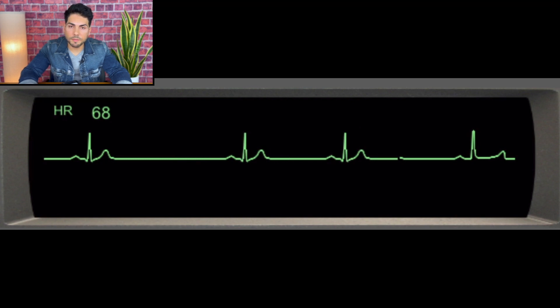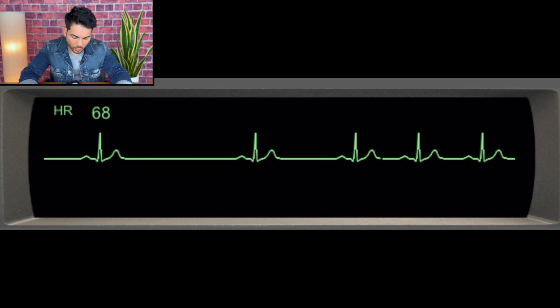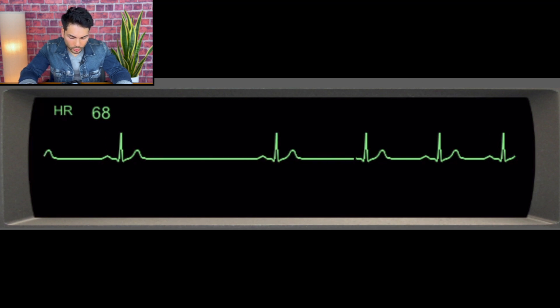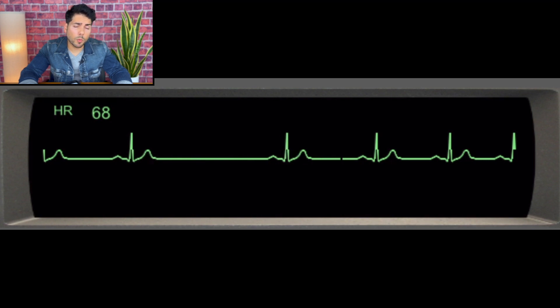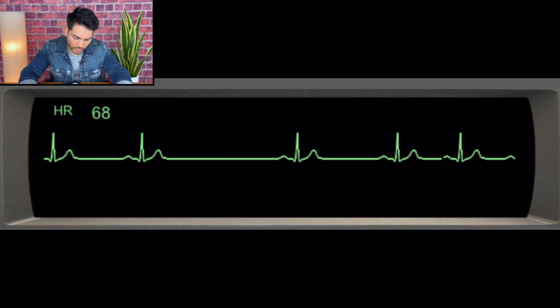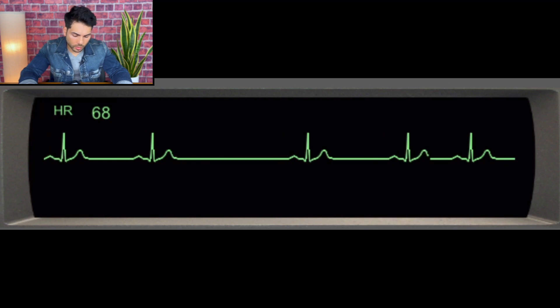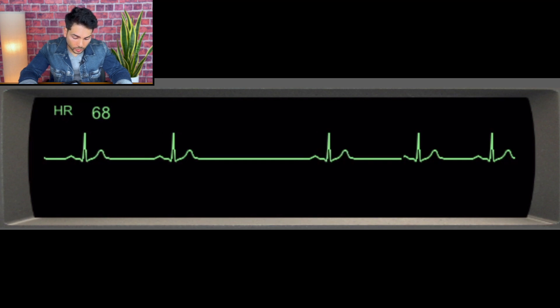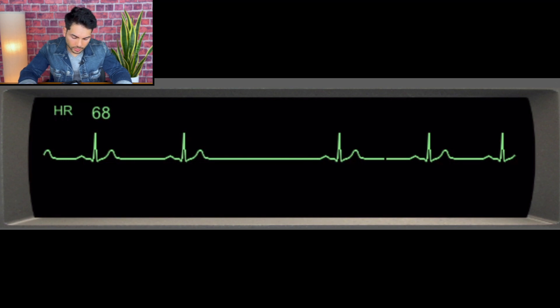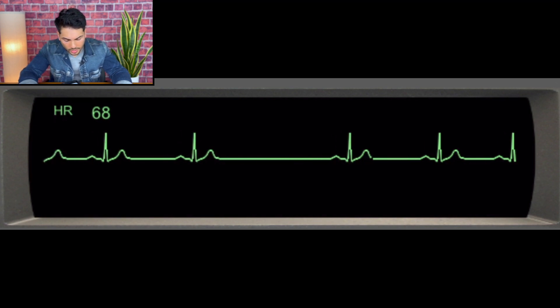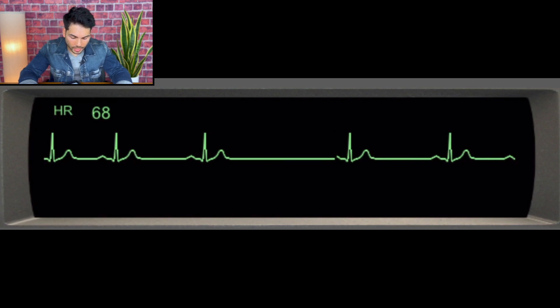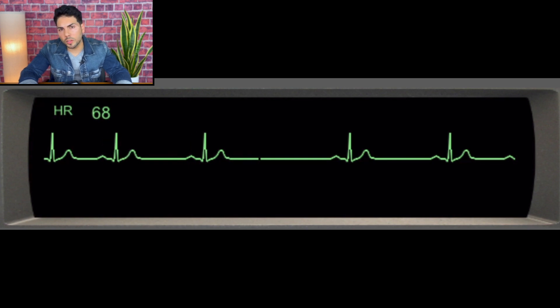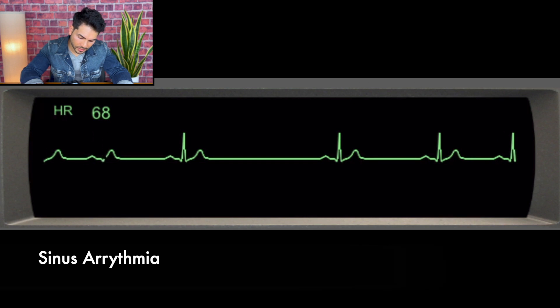Next example — same five questions. Are there P waves? Yes. Is there a P wave for every QRS in a one-to-one fashion? Yes. Is the rhythm regular or irregular? Looking at the QRS-to-QRS distance, it's slightly irregular — some variation. But we see P waves that share the same morphology. Is the QRS narrow or wide? Narrow. Is the PR interval prolonged? No. So we have a slightly irregular rhythm with normal P waves of the same morphology. This is sinus arrhythmia.